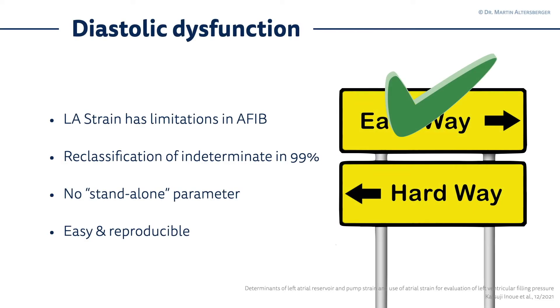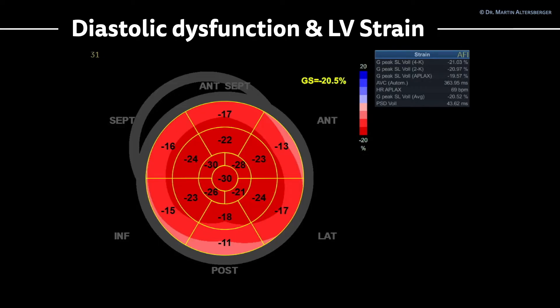In the previous lectures we discussed several measurements and included left atrial strain imaging in patients in indeterminate situations. We also covered diastolic dysfunction and left ventricular strain. In this lecture we will discuss the importance of LV strain in diastolic dysfunction. In this first image we have a patient with a reduction in basal strain but overall a normal global longitudinal strain.